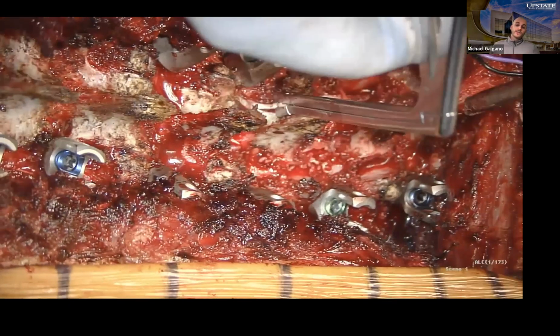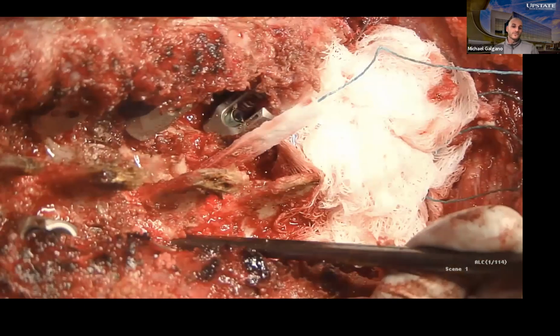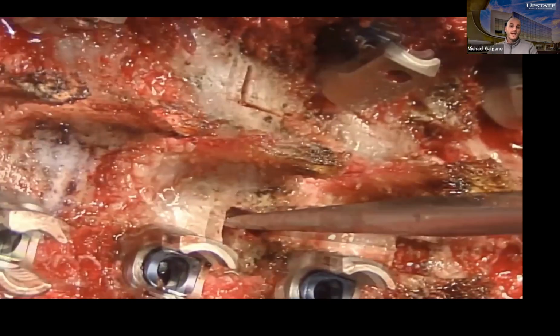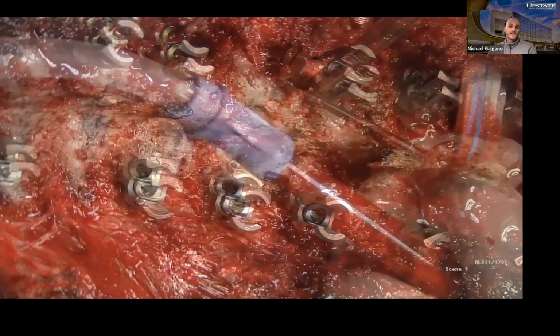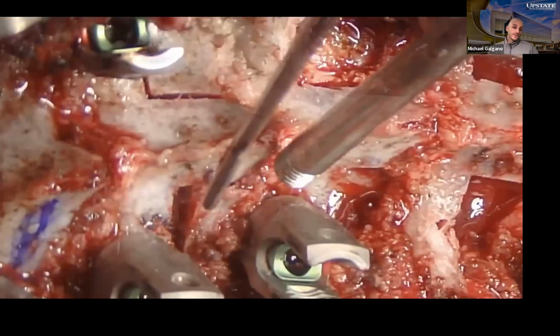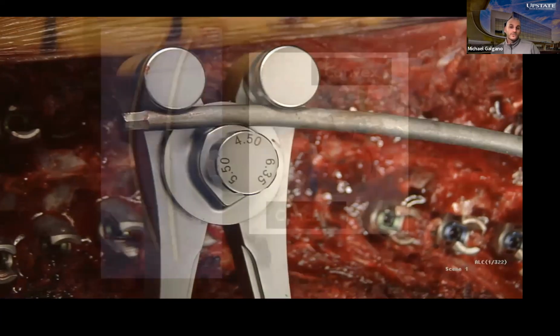Now, as far as the levels I selected for osteotomies, I basically do inferior facetectomies at every level, and then I do a complete Ponte osteotomy from L1 down to L4, completely take the facets out, and basically cut across the pars. Now, this is a great device here. This is not the Misonix. This is actually the Sonopet, and believe it or not, this is the tool that we use to take brain tumors out all the time in neurosurgery. But you could put a blade tip on it, and it acts just like a Misonix, but it's actually lower profile. So this is what I use. You get a lot of nice autograft from it, and it's a very precise bony cut, and it doesn't bleed at all.